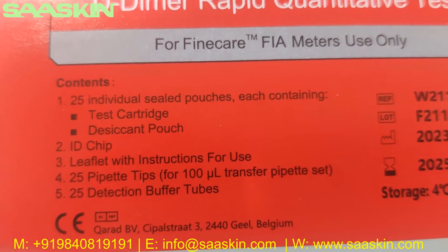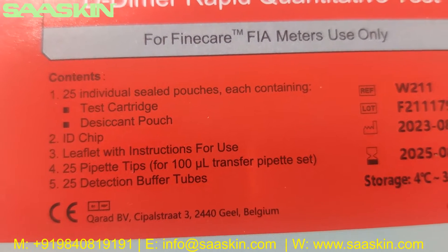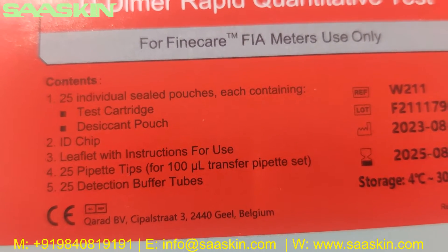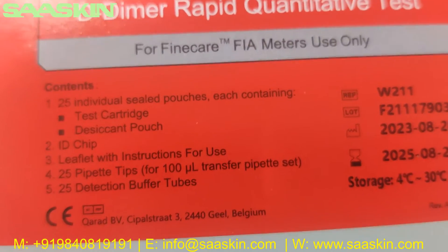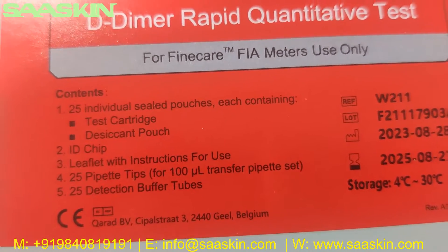Looking at the contents on the box: you have 25 individual sealed pouches, each containing a test cartridge and a desiccant pouch, an ID chip, and a leaflet with instructions for use, 25 paper tips, and 25 dilution buffer tubes.